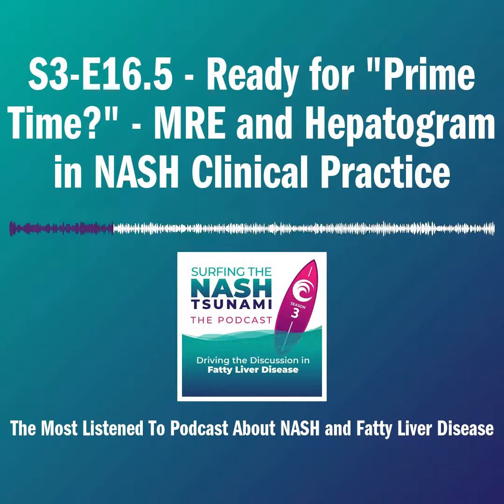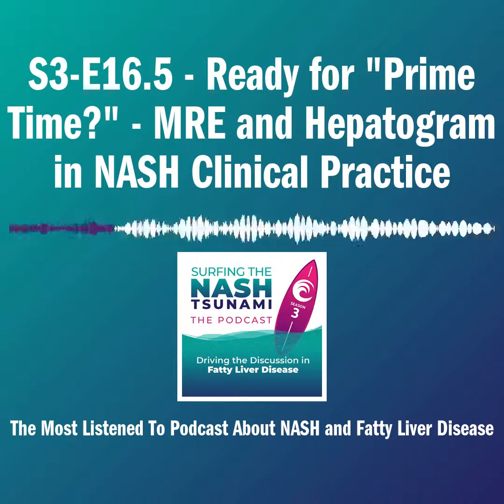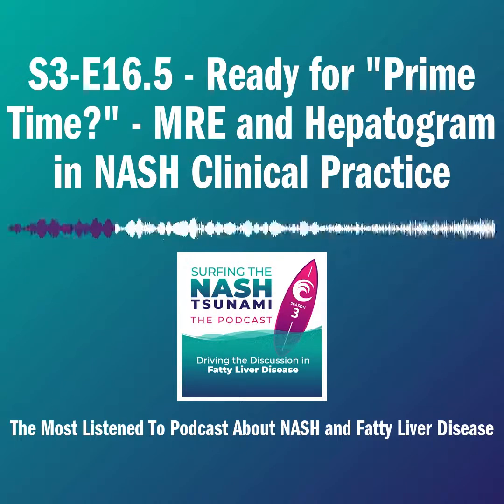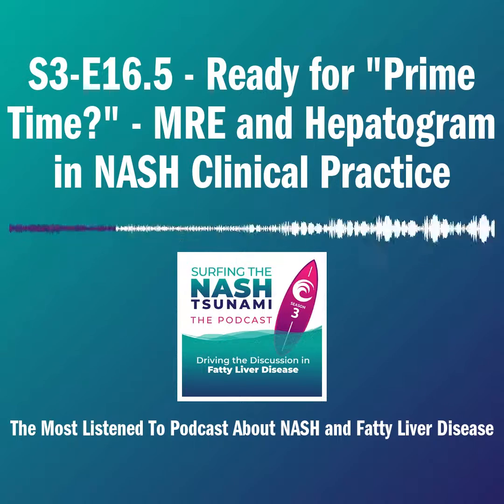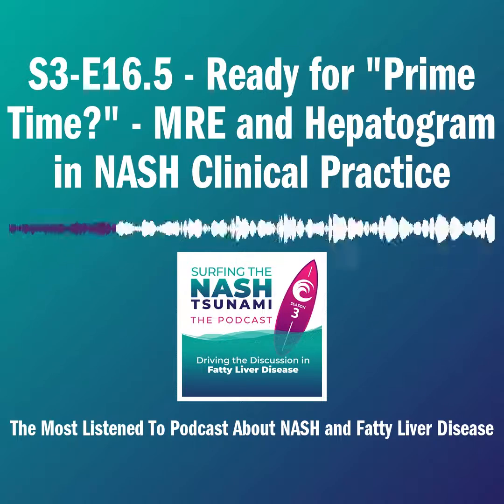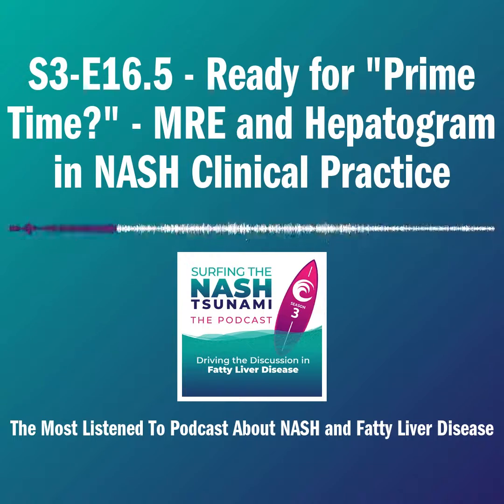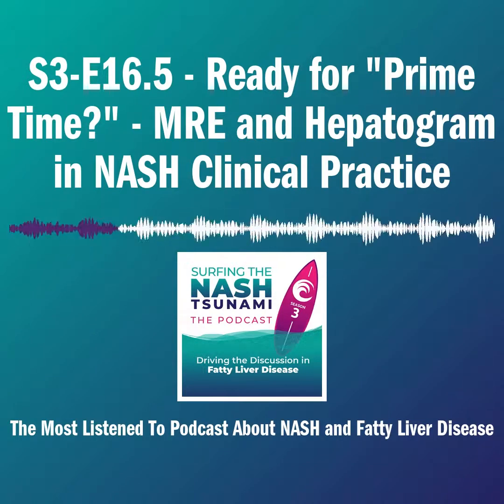The MAST score did also, again, detect NASH and F2, other than the great area under the curve. Very good NPV and sensitivity, reasonable specificity, and reasonable PPV for the population we studied. I then reached out to Stephen and I asked him to share with me his cohort, which is the well-known cohort that he's recently published, the JHEP prevalence paper. So we used that cohort with the parameters I mentioned, and we validated that MAST score.